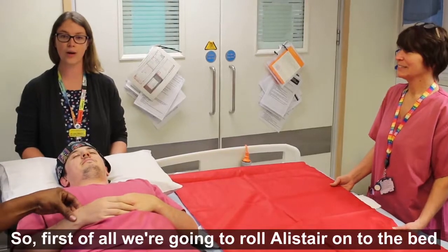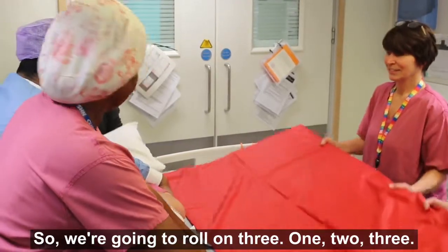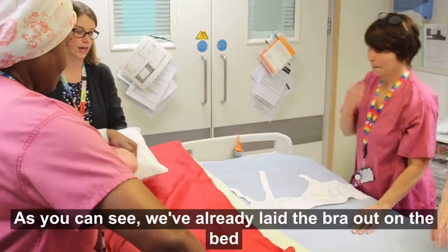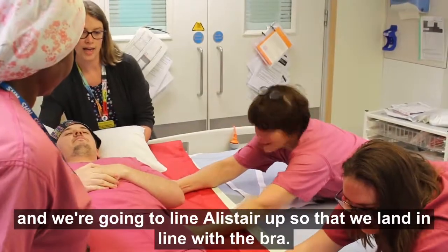First of all, we're going to roll Alistair onto the bed. As you can see, we've already laid the bra out on the bed, and we're going to line Alistair up so that we land in line with the bra.